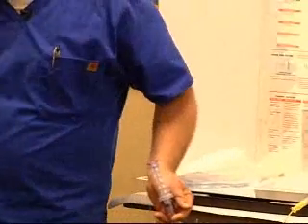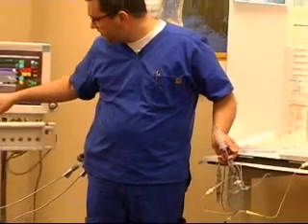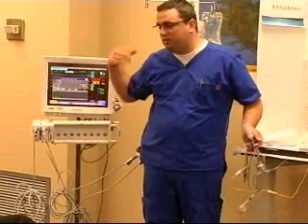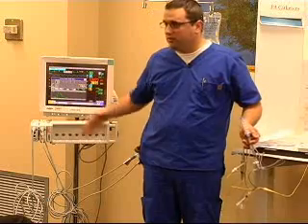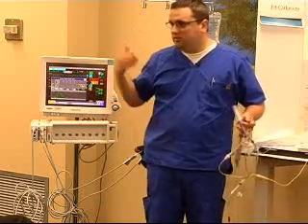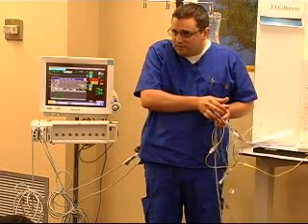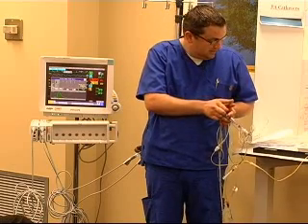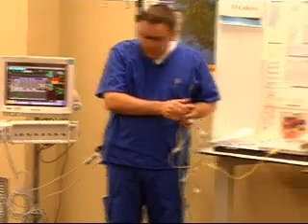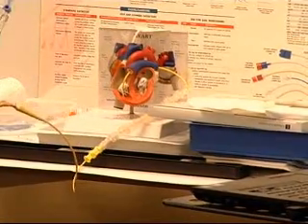So whenever you do your cardiac output, hopefully you're going to get a nice bell curve here. The bell curve is going to tell you basically that your fluid traveled into the right side, got back across, and your temperature went back to baseline. You're looking for a very quick up curve. That means that you injected it quickly enough. If you kind of prolong the injection and you're just kind of going like this, you're not going to get a good example. Yeah, I've got a leaky right ventricle. Yeah, beware of the leaky right ventricle. But anyway, you're not going to get very accurate numbers, and so let's do another example.